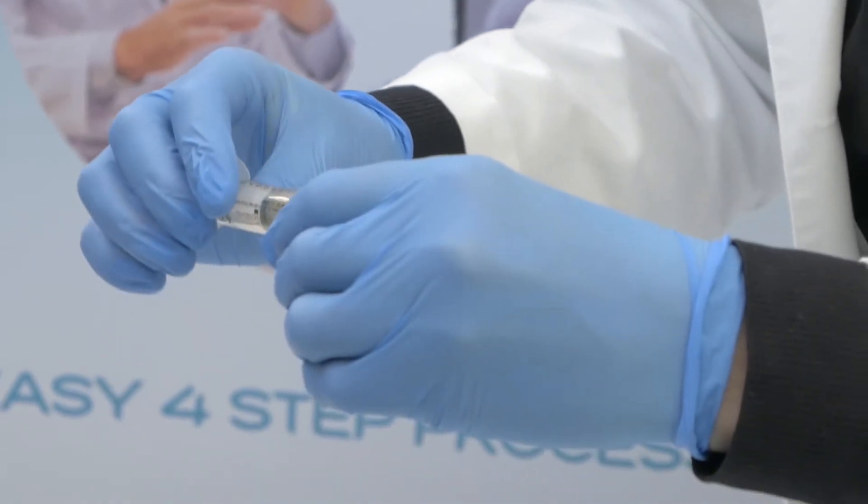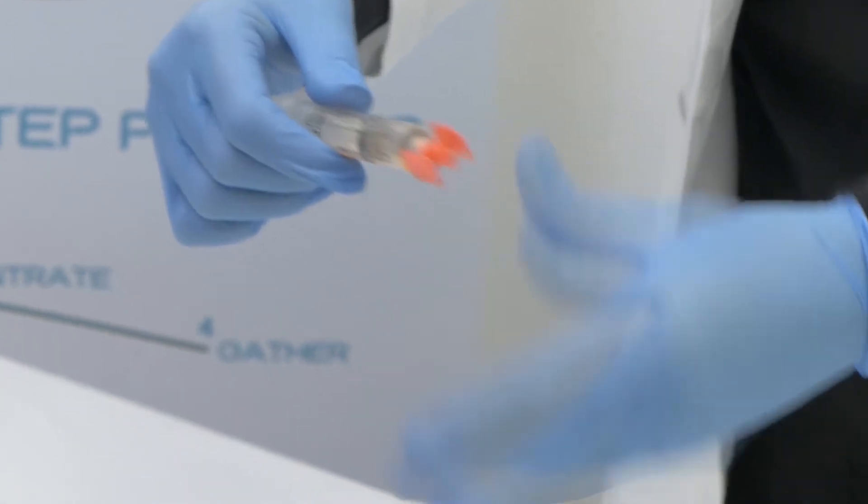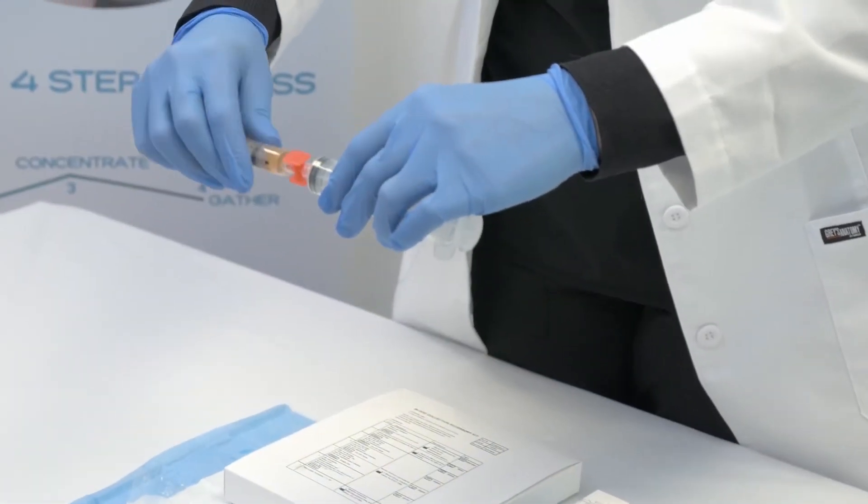Insert 2 ml of sodium citrate from the citrate syringe into the 30 ml syringe using the red luer lock to luer lock connector.